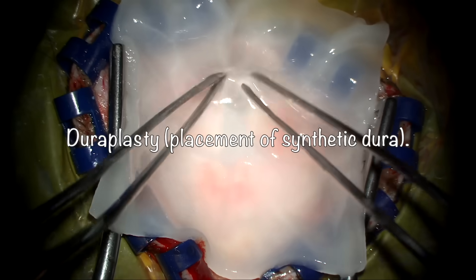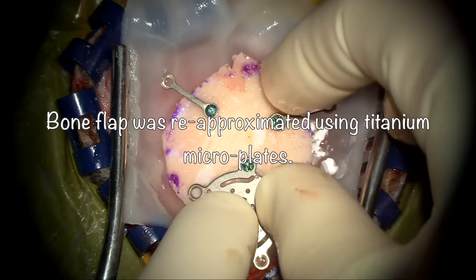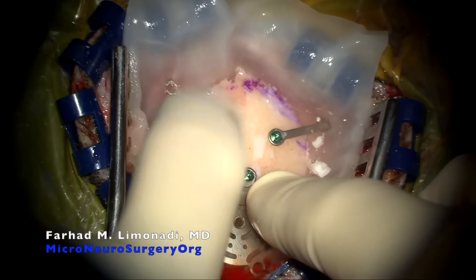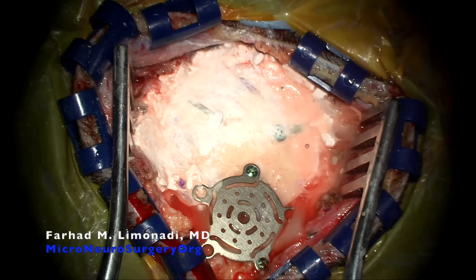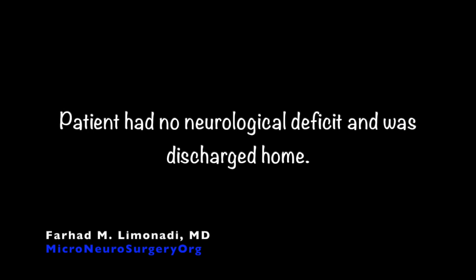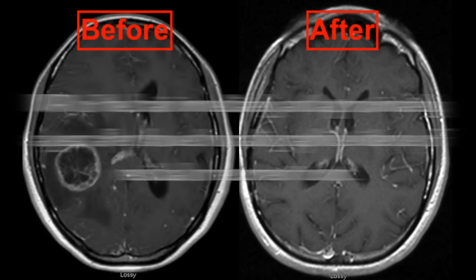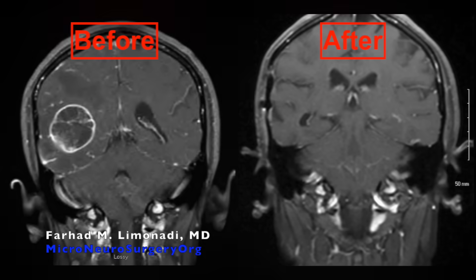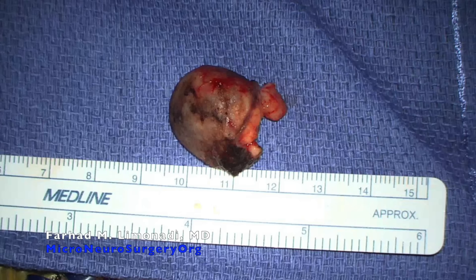The dura is re-approximated and duraplasty completed. The bone flap is re-approximated and the border between the bone flap and the cranium is covered with a synthetic agent to achieve a better cosmetic result. The patient had no neurological deficit and was discharged home. Post-operative MRI scan of the brain immediately and approximately one year after showed no radiographic evidence of residual or recurrent tumor. The pathology, unfortunately, was glioblastoma multiforme with MGMT promoter methylation and IDH1 or IDH2 mutation not detected.